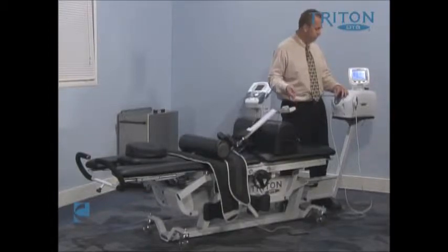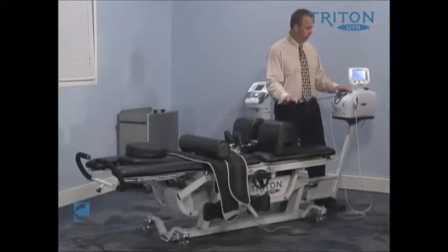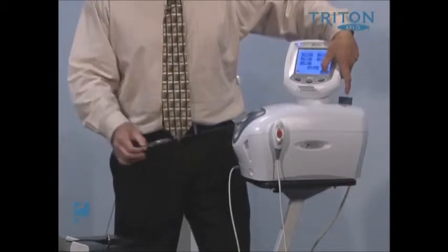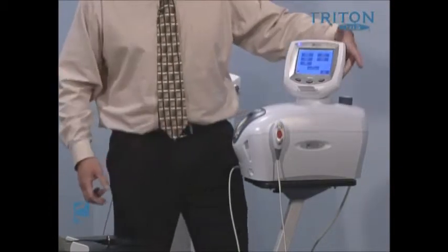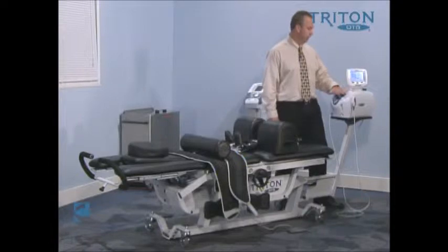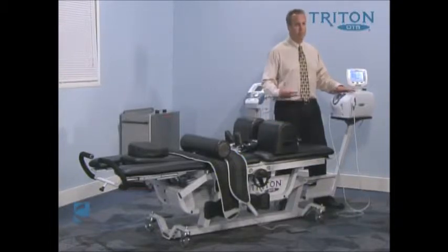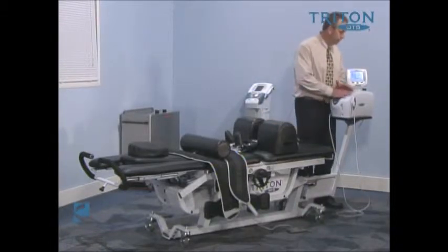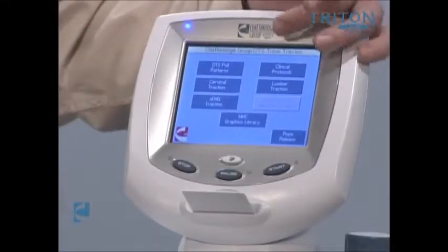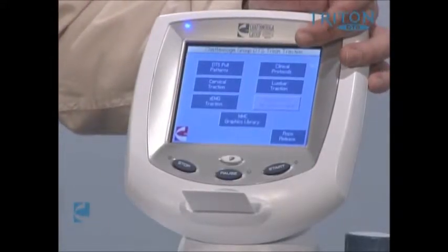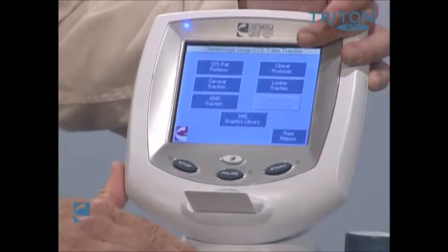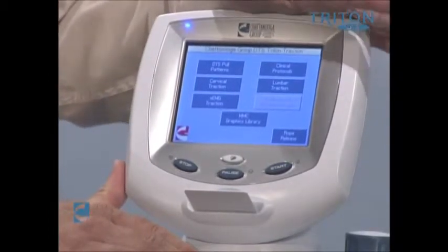This will attach to either the cervical piece or to the lumbar piece as we pull for lumbar traction. Everything is a touchscreen. The biggest advancement of this DTS system is the processing that allows us to manipulate all of the parameters.